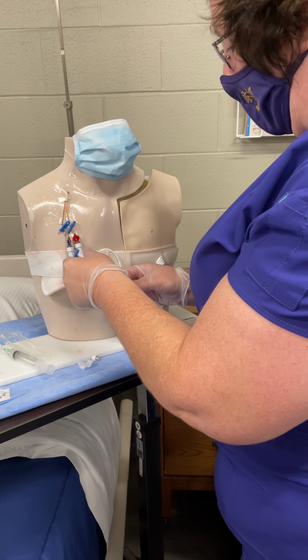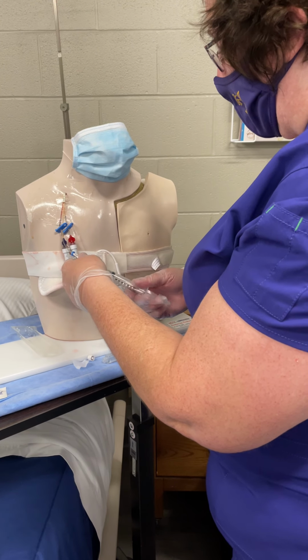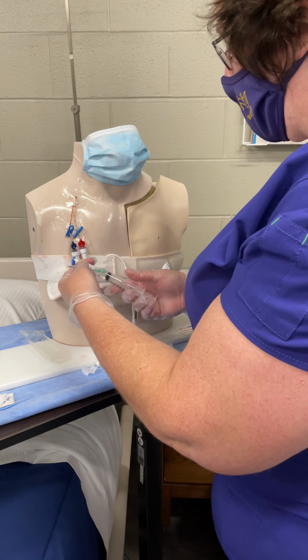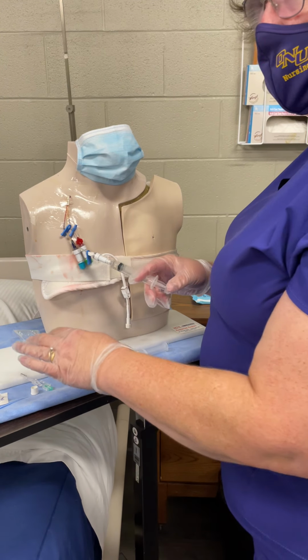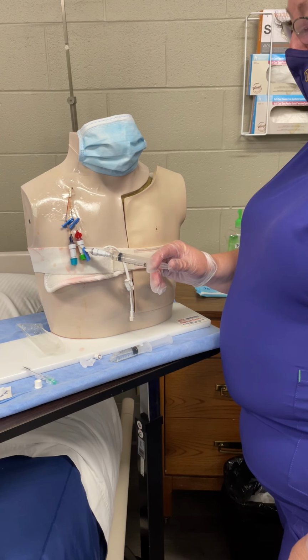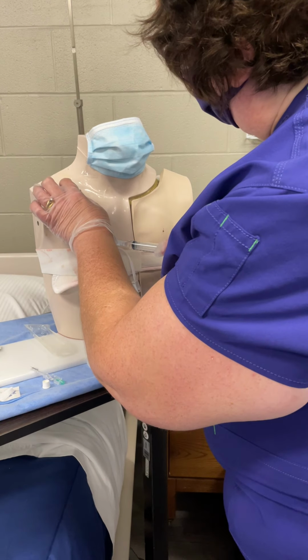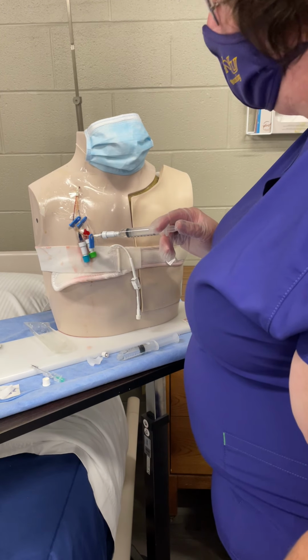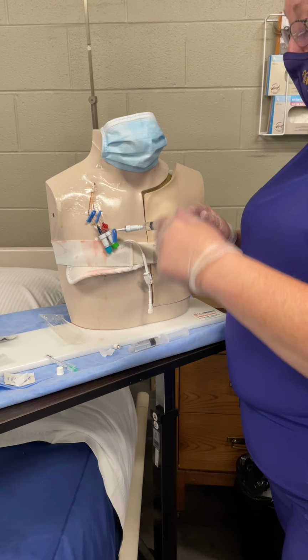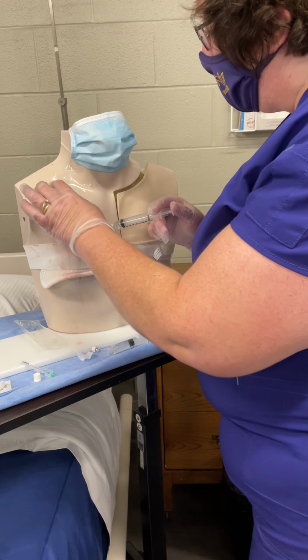Then get your Lasix. We're going to connect it. And that's when you'd start that clock, right? Yeah, so watching that time, giving that Lasix. Is our line leaking? So would we want to give meds if our line's leaking? No. So we would have to stop and call that surgeon and find out why this darn thing's leaking, right?